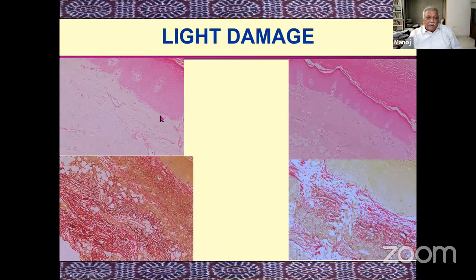And coming below the basement membrane, one region which you might like to keep in mind is the top few millimeters of the dermis. It is structurally and functionally different from the rest of the dermis. This is the so-called Grenz zone, G-R-E-N-Z, Grenz zone. And especially when you have light damage in sun-exposed parts, you have a degeneration of the uppermost part of the dermis. So you can make out that this is no longer the nice pink collagen which you usually see.